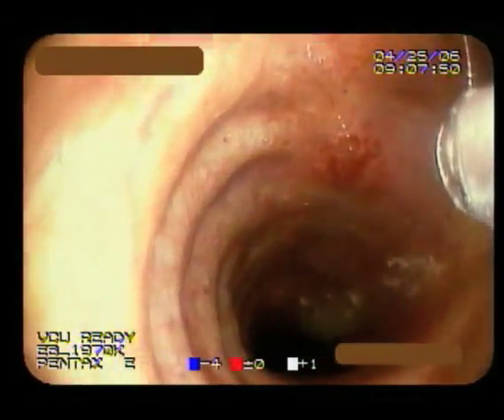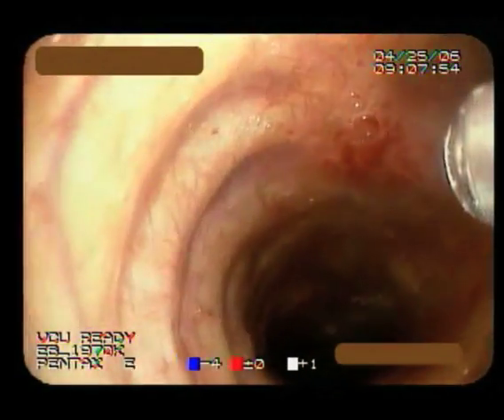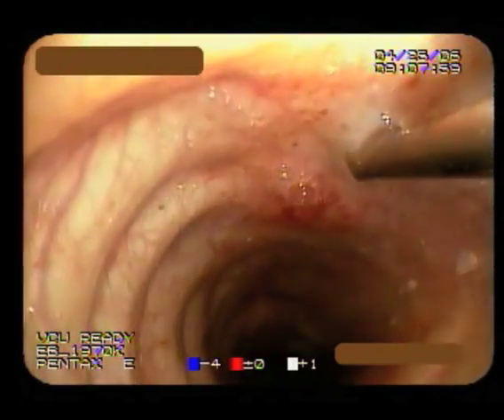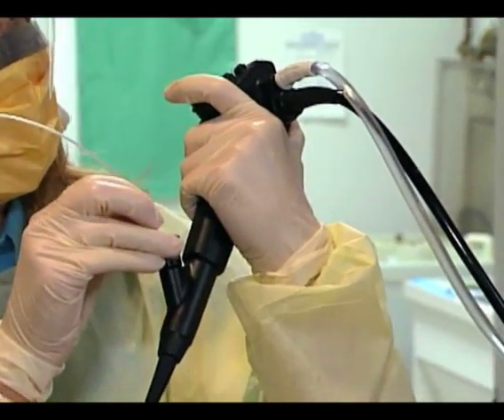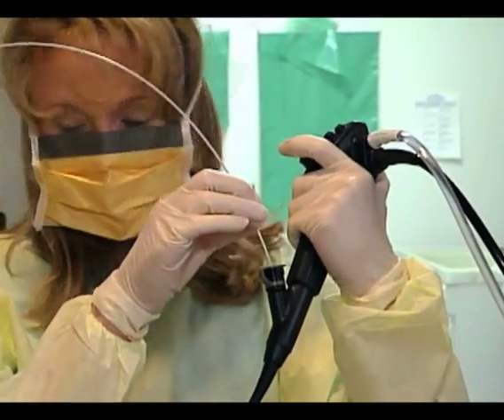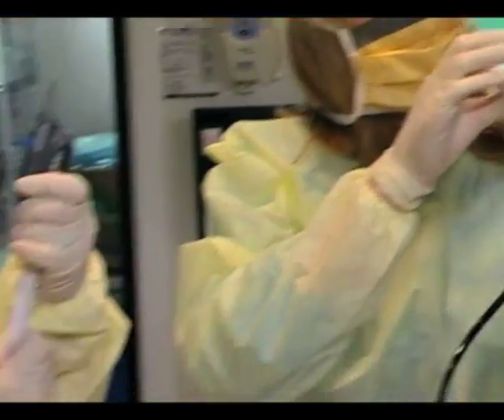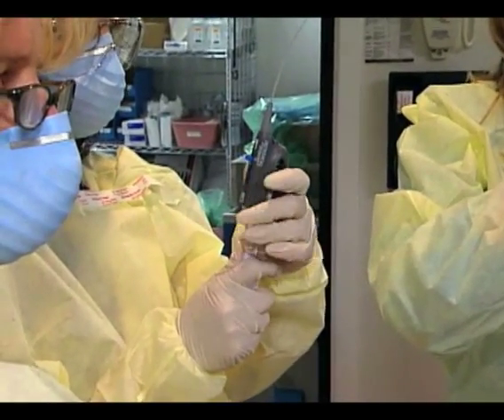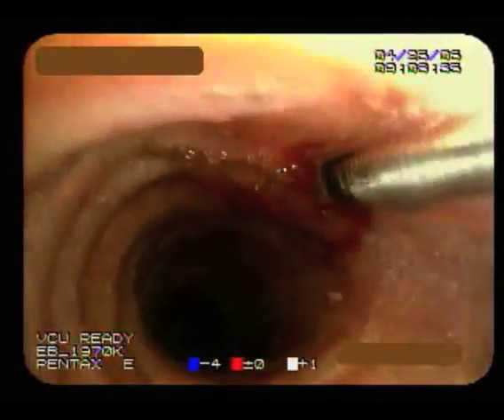At this point I'm coming up to my target, and I'll ask my assistant to place the needle out. I'm using a technique of feeding the needle to the mucosa. I have an assistant to hold it in position, and as I advance the needle into place, I can feel a very strong pop to the mucosa. I know that I'm in it, and at this time I apply suction, securing the scope, and I'm just agitating gently back and forth.